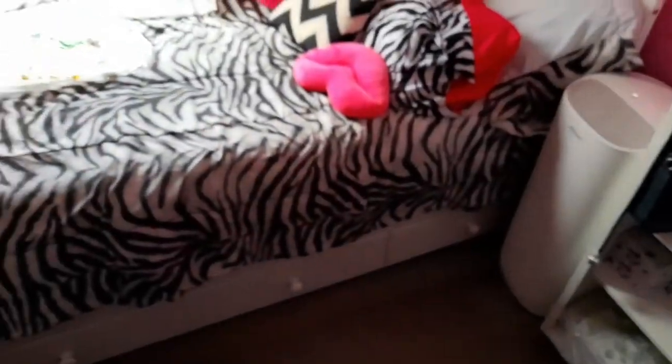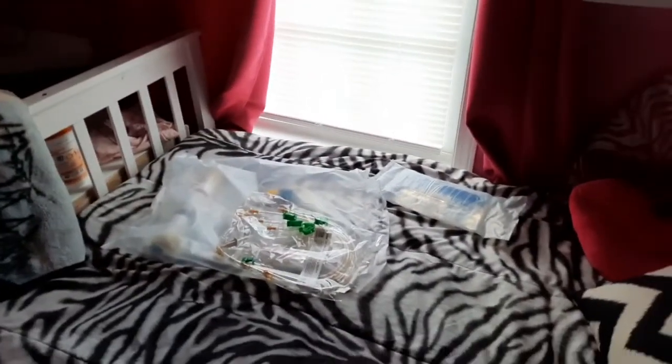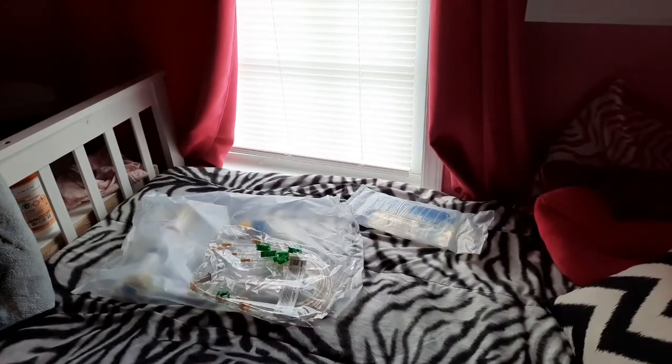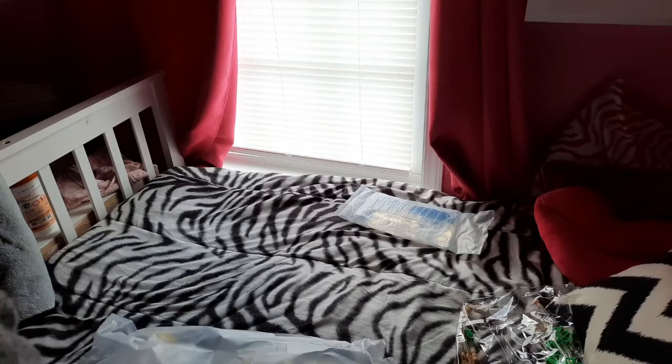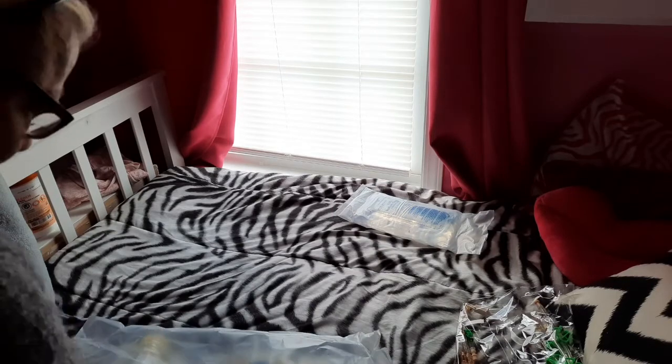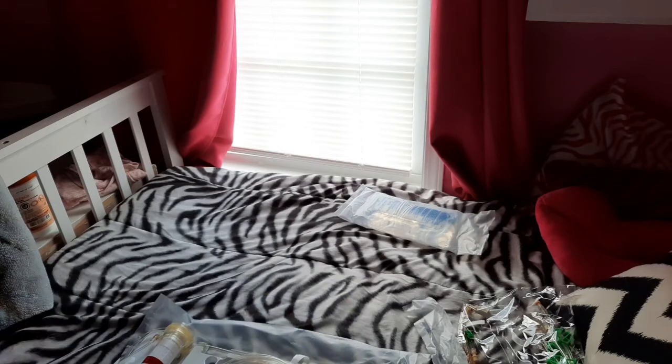All right, so now we're going to open up our cartridge, and here's how we do that. On one side of the bag, there's perforated lines. Just tear that open, slide off the cartridge, and put it on top of the bag. Save the bag. Don't throw it away, because that's what you're going to wrap this up in at the end and stuff it in there. Use it as a trash bag.